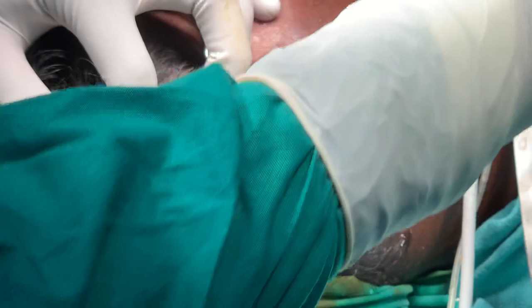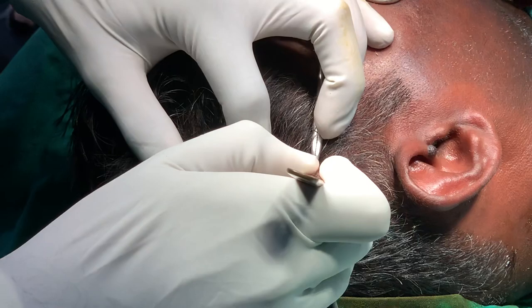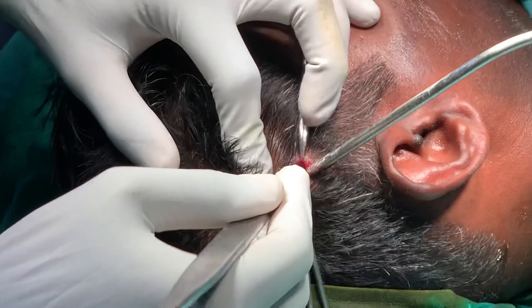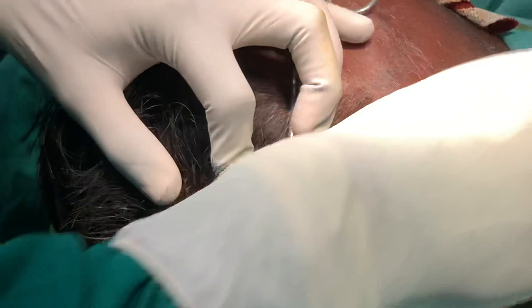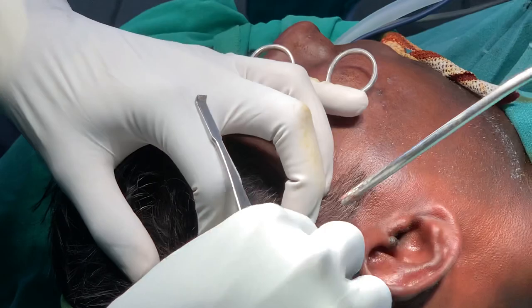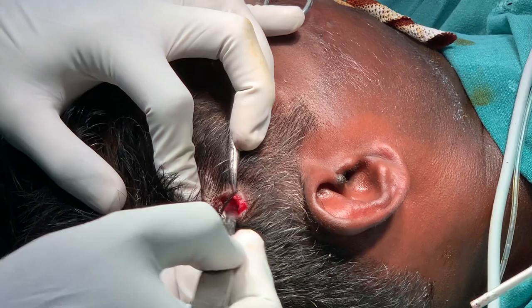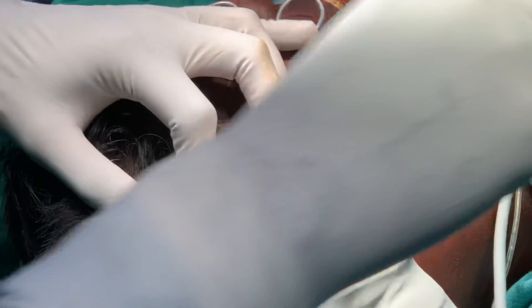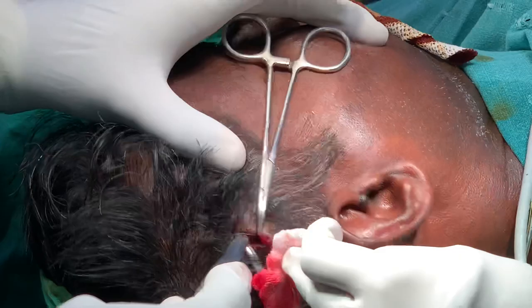You might want to extend the incision — for demonstration purposes I'm going to show it a little bit clearer. Now the knife — this is just a small scoring incision over the fascia, to get to the plane beneath it.